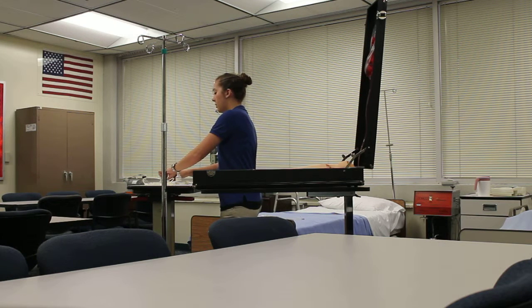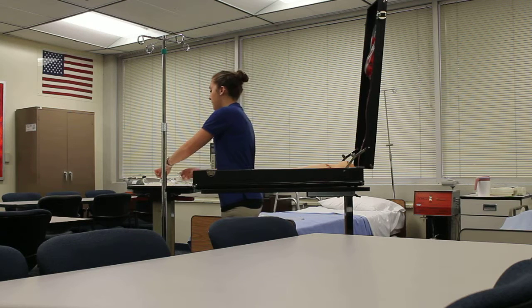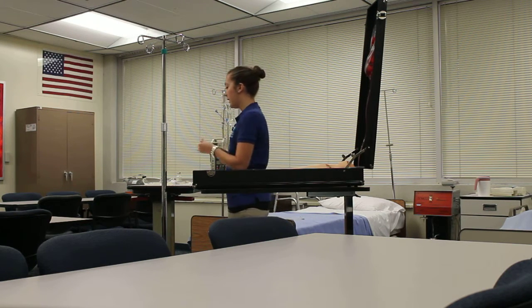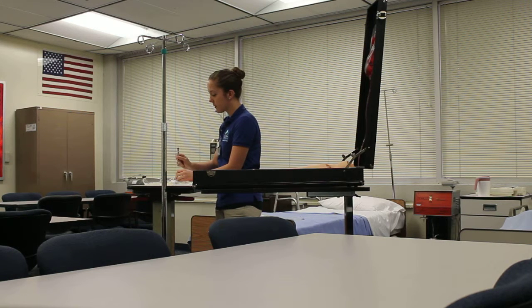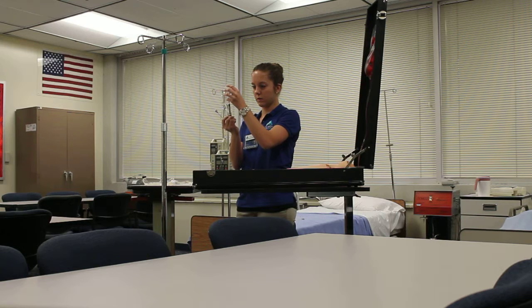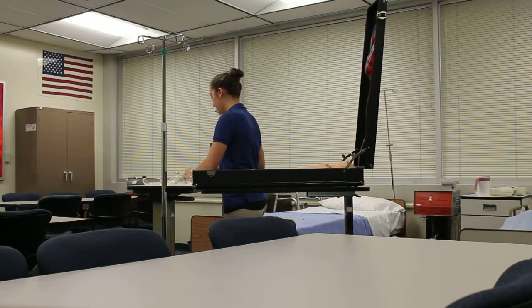I can open an alcohol prep, swab the top of the vial, draw up a ml of air, uncap my needle, inject the air, and then draw up a ml of the medication. And then I would recap my needle. I can go ahead and inject it into the primary bag.